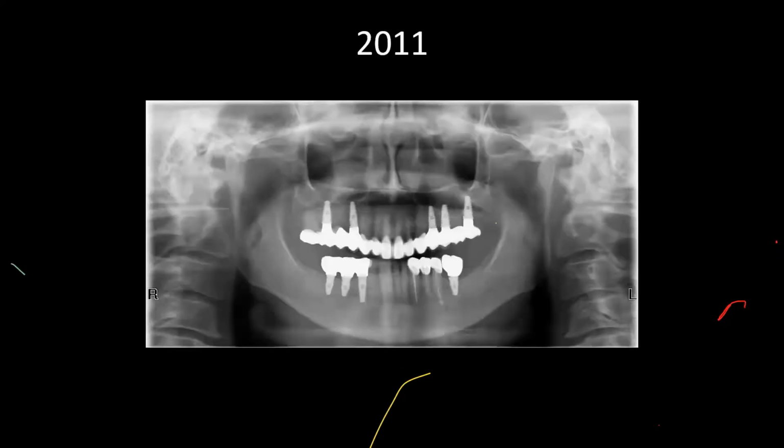From 2011 we went back; this is 2015, and you can see I maintain the posterior tooth. Although I had a poor prognosis, we could always remove that tooth and section the posterior crown from it. That's always an option, but it's held very well. The bone levels and the attachments are very good. My oral health therapist, Christy, checks them, and she's very happy with them.